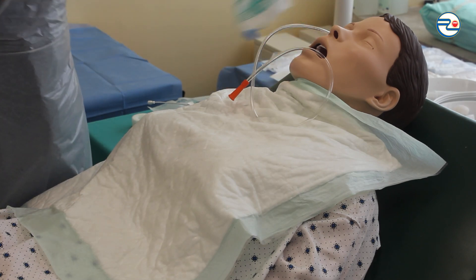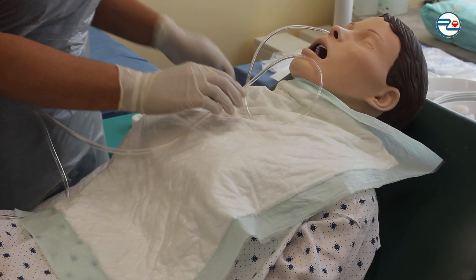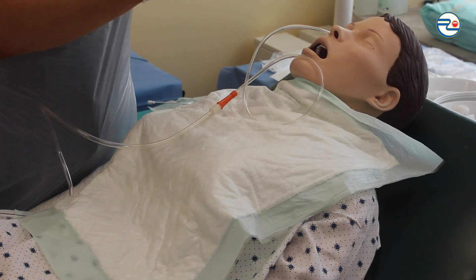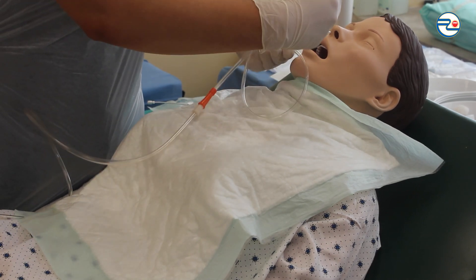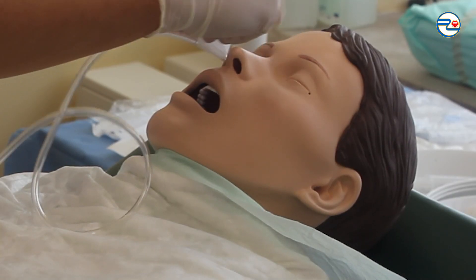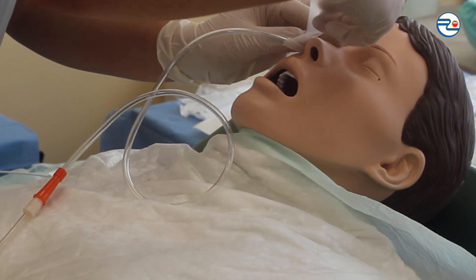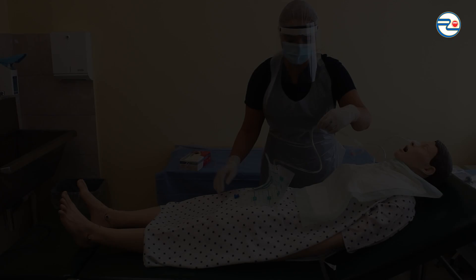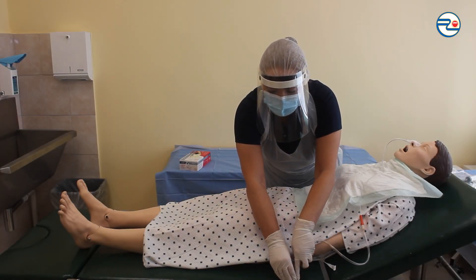Connecting the collection bag to the tube and fixating the tube to the nose with plaster. Fixating the collection bag below stomach level without allowing it to touch the ground.